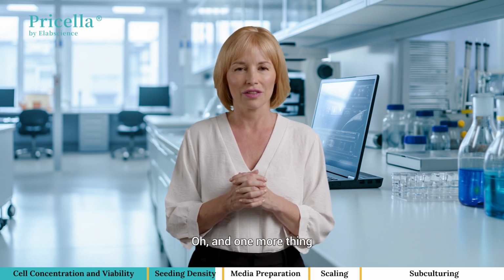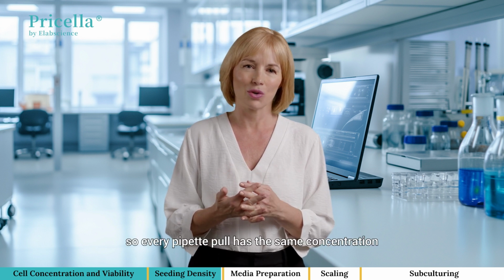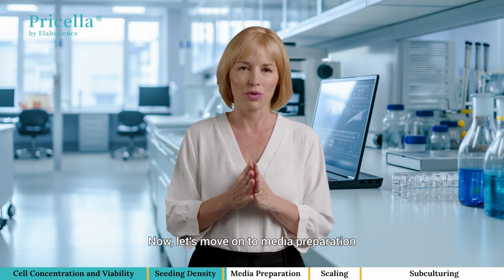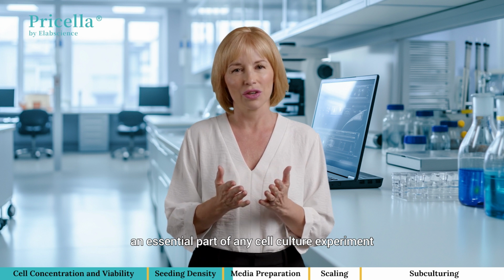Oh, and one more thing. When you're seeding cells, make sure to mix your cell suspension well, so every pipette pull has the same concentration. Now, let's move on to media preparation, an essential part of any cell culture experiment.